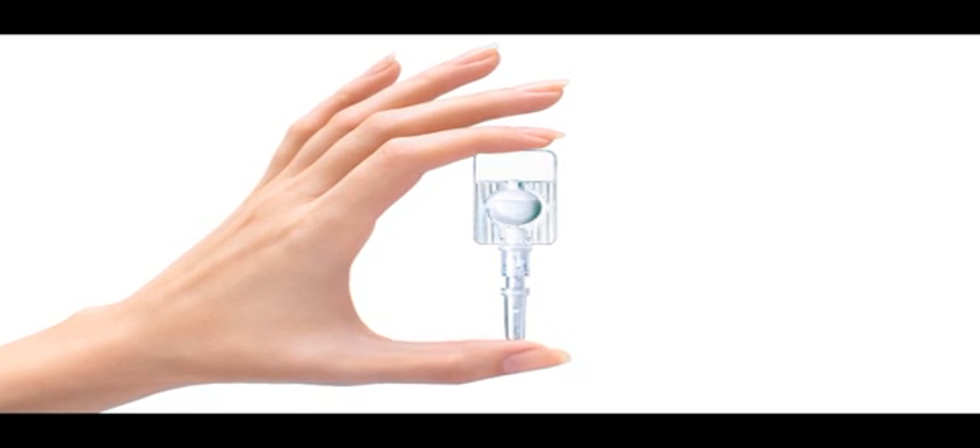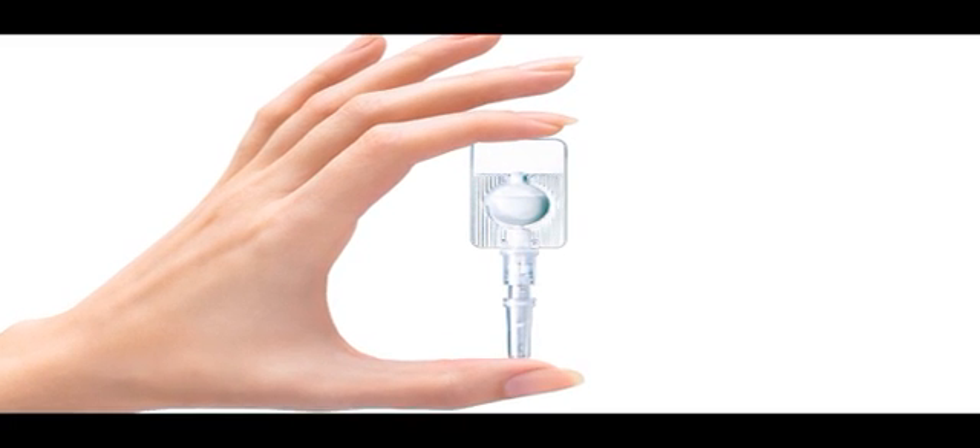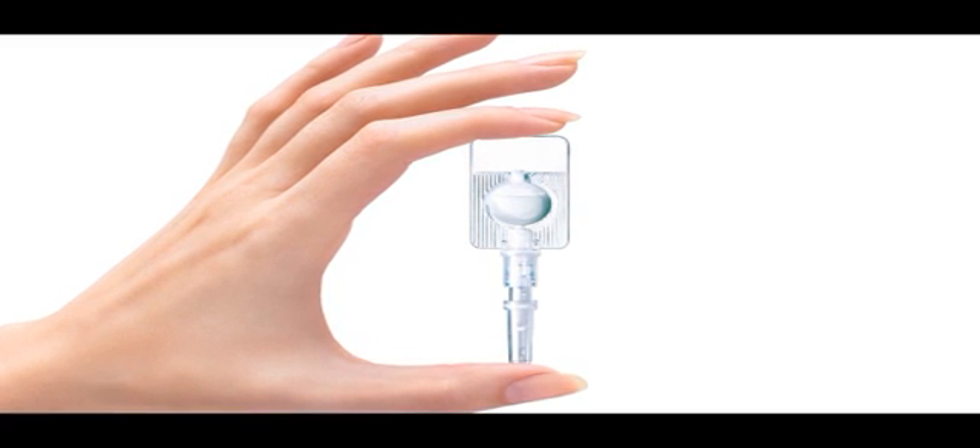Cyanopress is an injector device which provides contraceptive cover for 12 to 13 weeks. It will be different to what you may be used to. It is therefore very important that we pay particular attention to how Cyanopress is injected. The process of delivering the dose is a simple one, but before we start the following points are important to note.